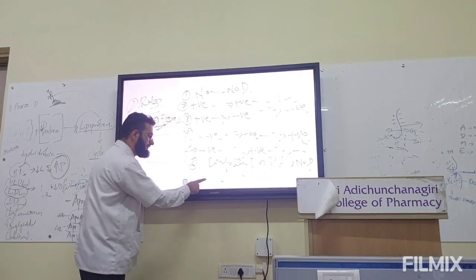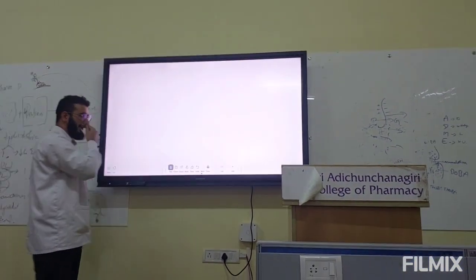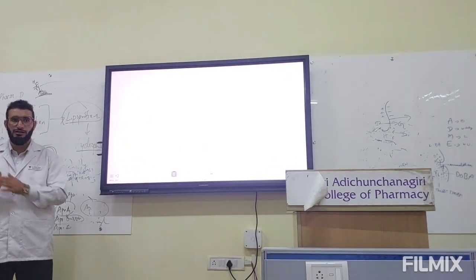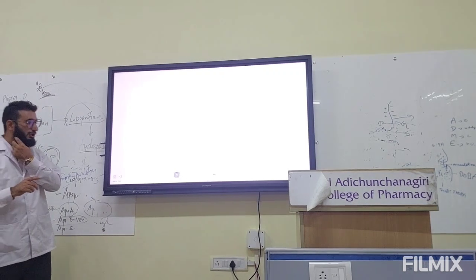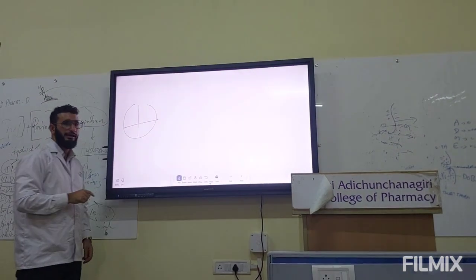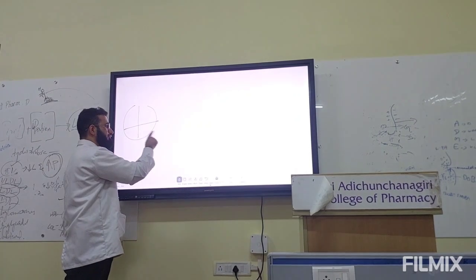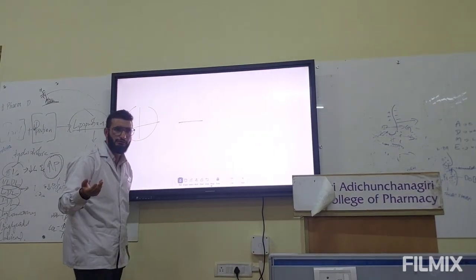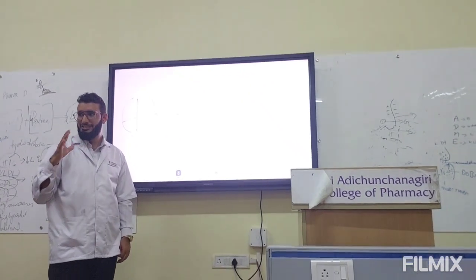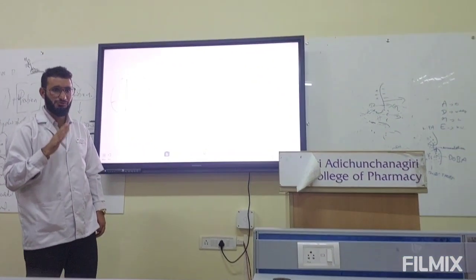Okay. So another rule we have. I told you a while ago which part is the fast conductor? Ventricle. So when the current is passing through the ventricle and we apply the galvanometer on it, do you know what a galvanometer is? In physics, you may have studied this too.